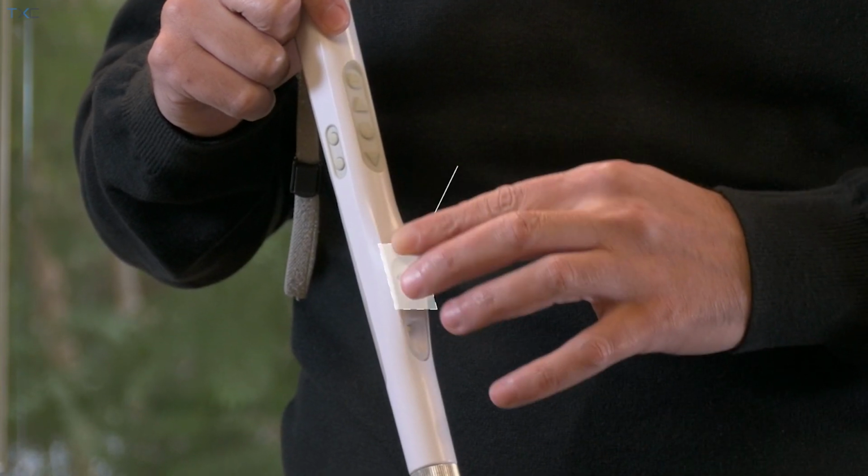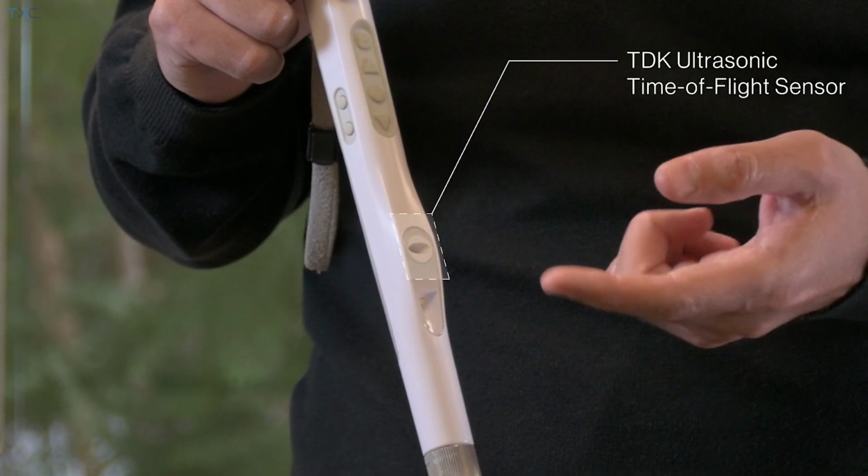One of the challenges is really how to make sure the ultrasonic time of flight sensor can accurately and consistently detect obstacles, like overhead obstacles. That involved a lot of trial and error, and also the algorithms behind it, when you receive the signal and how you characterize it as an obstacle, and then send that information in real time to the processor or to your apps, and then react. For that one, I know we worked together with WeWalk.